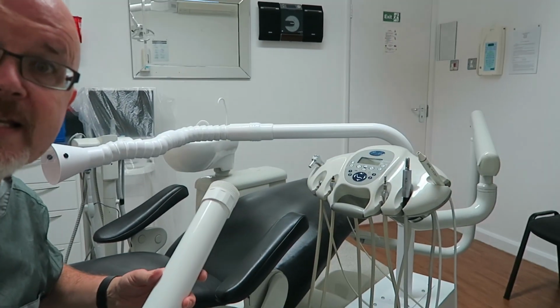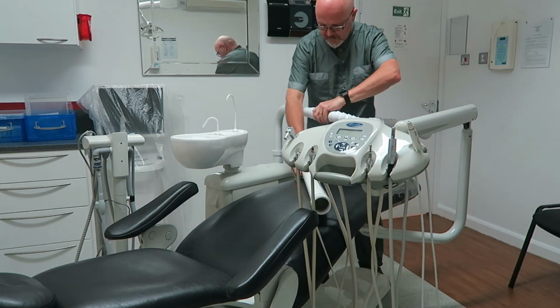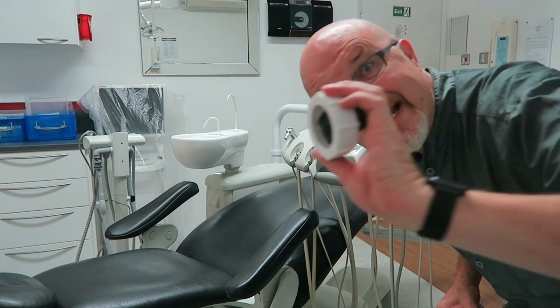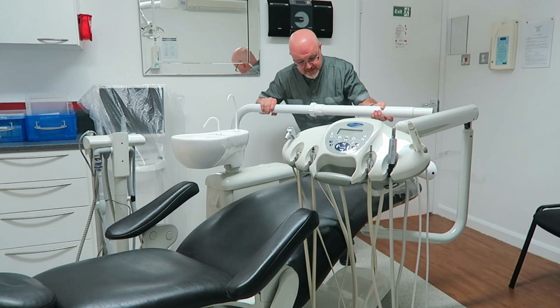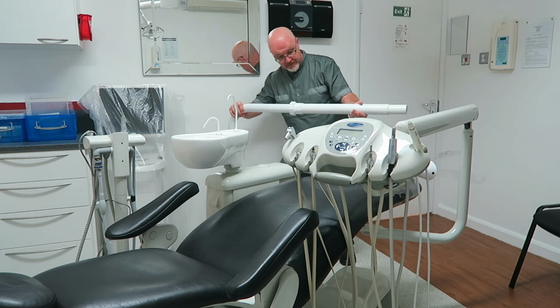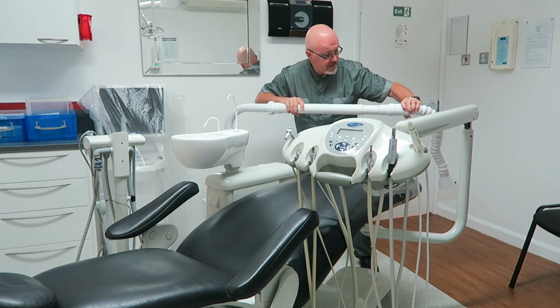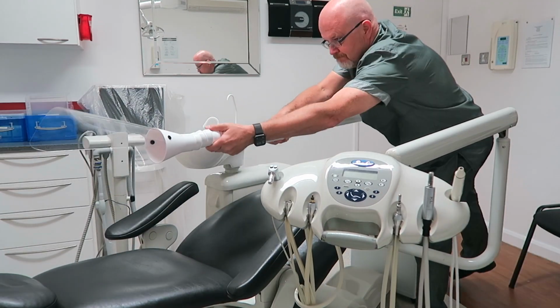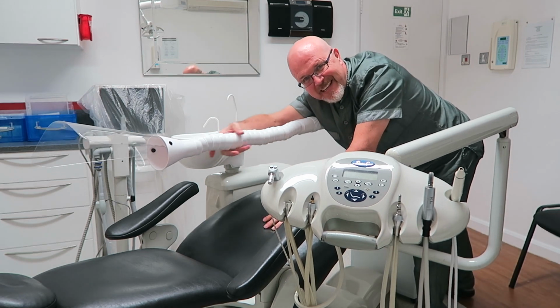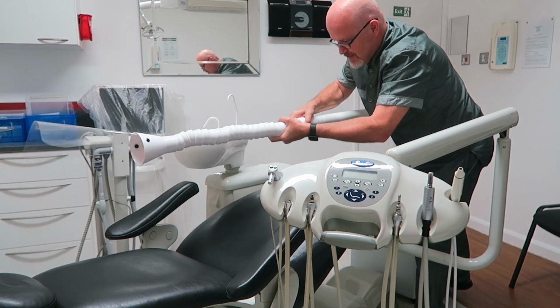So what I'm going to do is to just pop this into place, and I'll hopefully get this so that you can see. A few little adapters here. Now one thing to point out here is that this is also now telescopic. So that actually moves up and down like so, and then that fits onto the end of this arm here. Afraid I'm a little bit OCD with these things being straight. I don't know, that's crazy, isn't it? Because you could spend days doing that. Okay, so that's on properly in there.